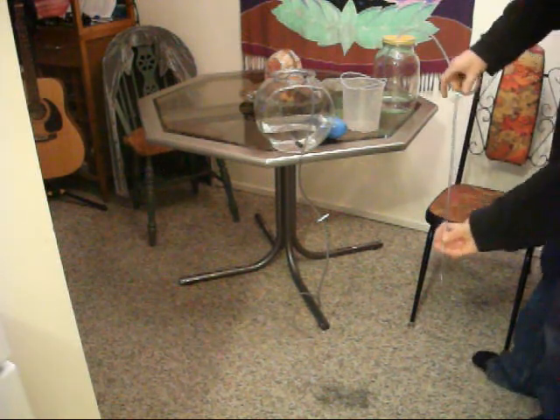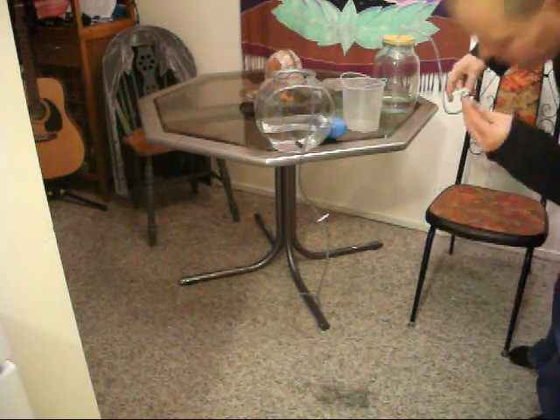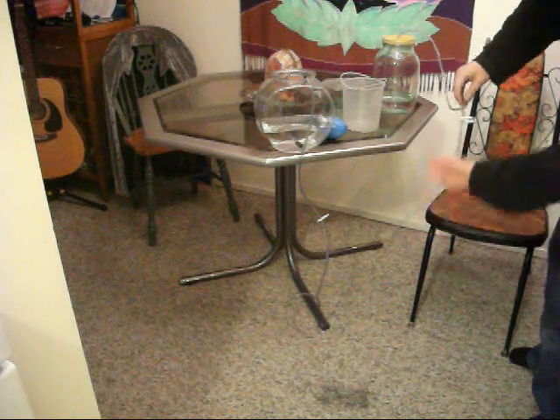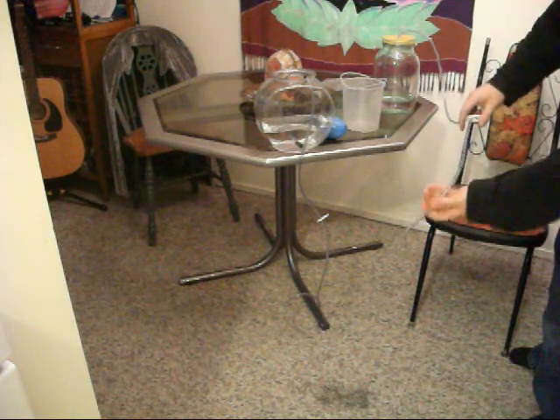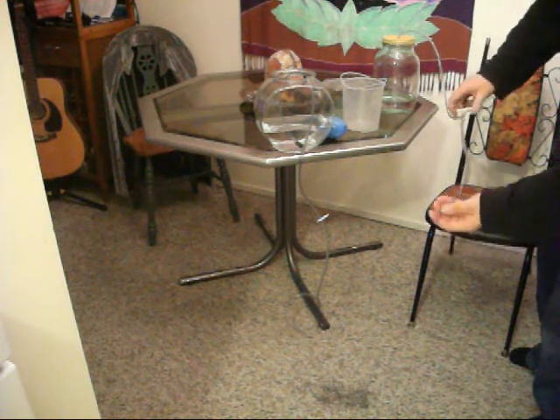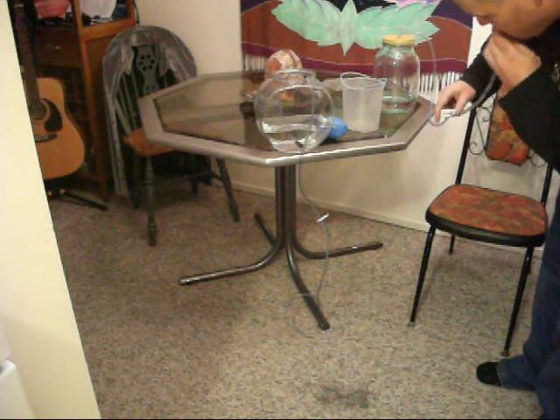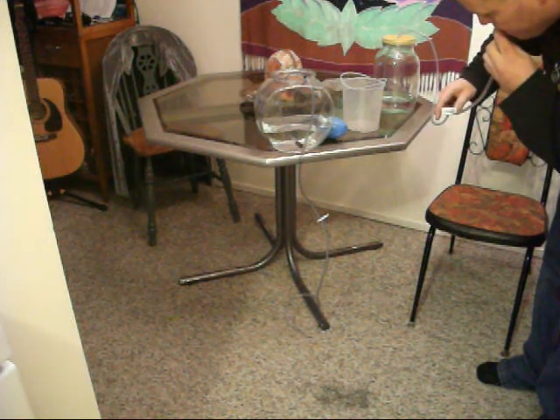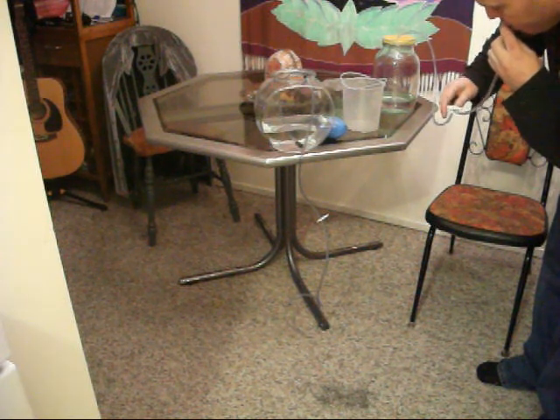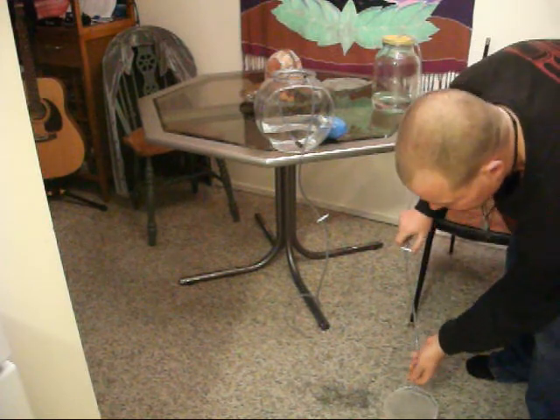But because there's no water in there, you see how it doesn't come out, just a little bit that was in there. So either suck it and siphon it, and you could just siphon it right to, let's say, right to here, so you don't even get any in your mouth. Turn it off, and then when you turn it on. So I'll give you a demonstration. I'll turn it on. Alright, there we go. And now turn it on.